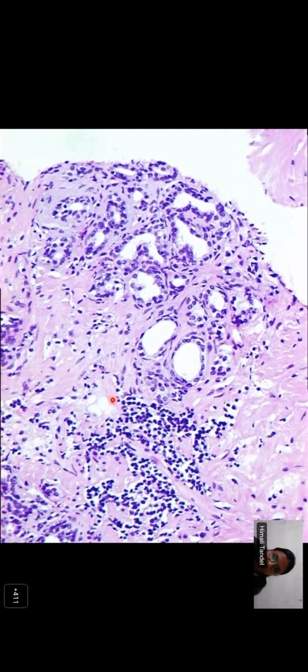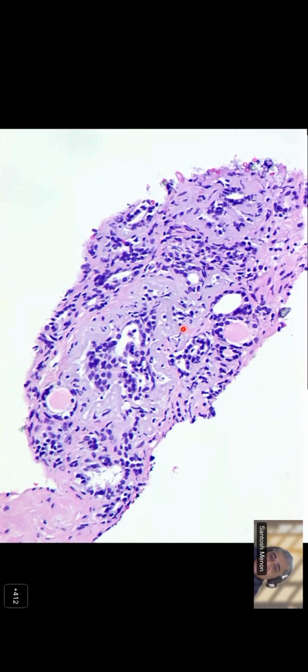Okay. What about these cells you see here? Lymphocytic. Yes, lymphocytic. They are chronic inflammatory cells. So they are chronic inflammatory, and these are your glands which are separated out. There is no fusion of glands much. Do you see the stroma here? A little bit of stroma. Yes, appreciated here, sir. In this slide, fused glands. Yes, sir.